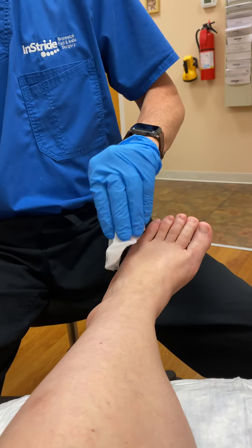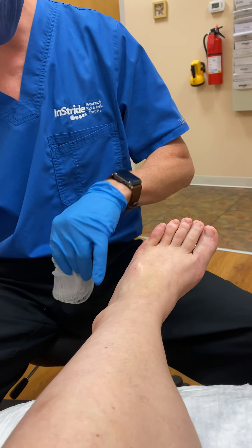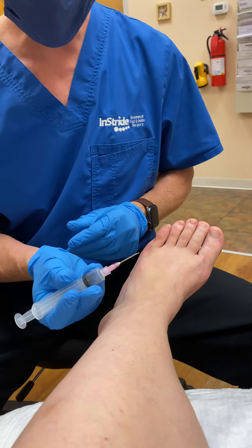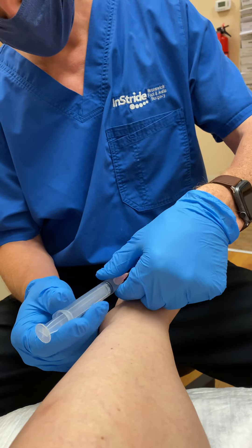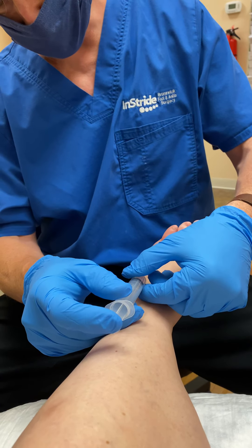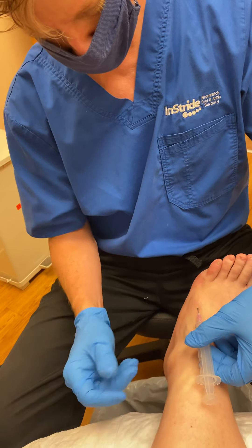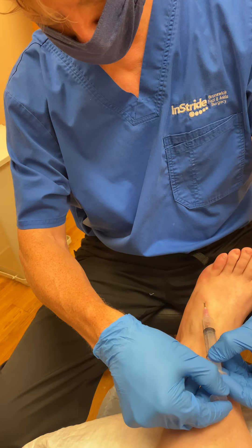We did a local anesthetic right where that little red dot is to numb up the skin, and we're going to use an 18-gauge needle to aspirate this area. We're going to stick that right in there — doesn't hurt, does it?